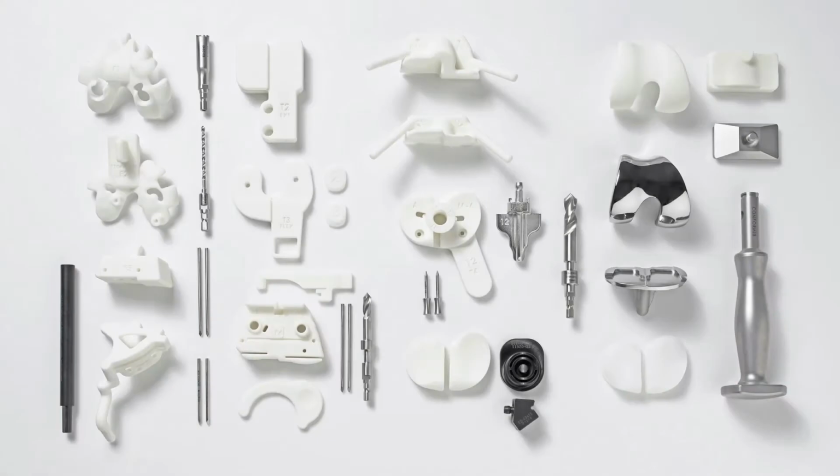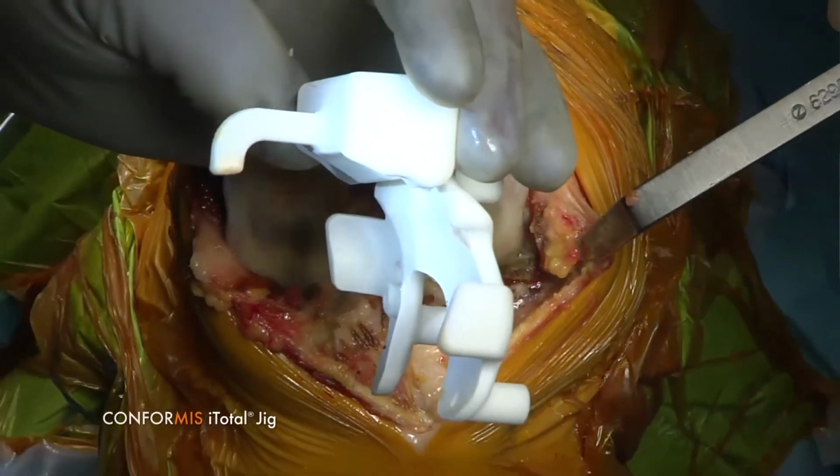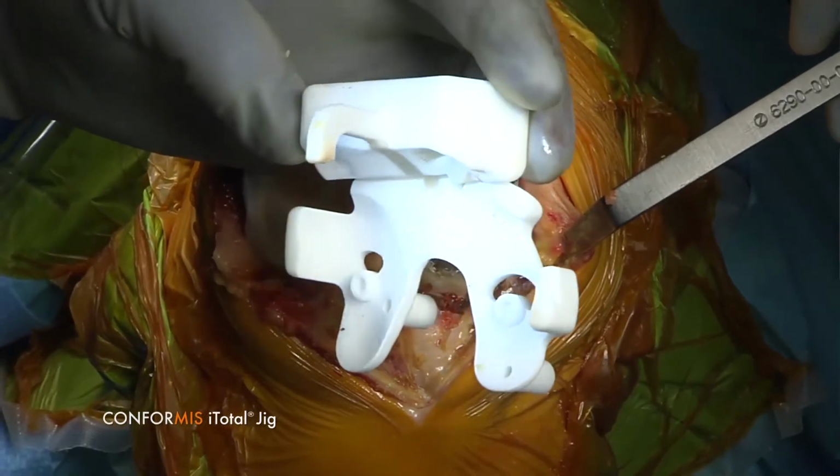The most obvious one is that patient-specific jigs fit perfectly. The jigs allow you to get the alignment right, the cuts perfect, the positioning perfect, and that's deeply reassuring. In terms of the bone that's resected, the bone cuts are very conservative. So you end up taking away just thin slivers of bone, compared to a normal knee replacement where you take away quite decent thick wedges of bone.